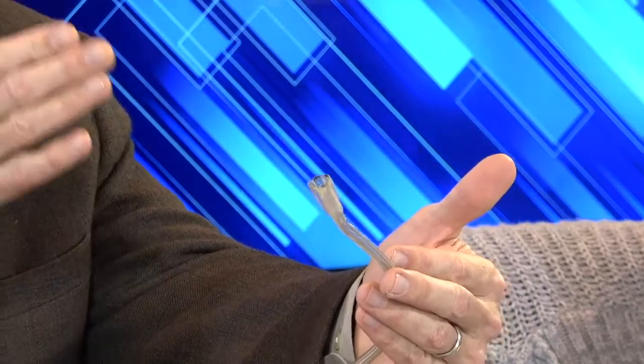These cases were done 100% via cut down when we first started, and they're still done via cut down sometimes today. So when we're looking to be able to do these, if Gore goes on a back order with their DrySeal sheath, which just happened about a month ago, and has been resolved, there is another option.